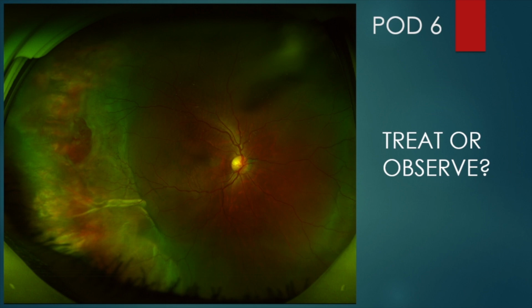Add some laser maybe. Where should we laser? Sir, is it a retinal fold or SRF? I cannot make out if it is SRF. So I said maybe we can add some laser. Okay, so the second option is laser. Okay, so next one, go ahead.